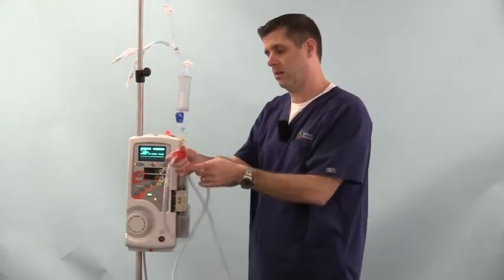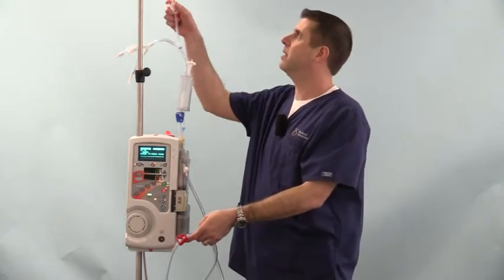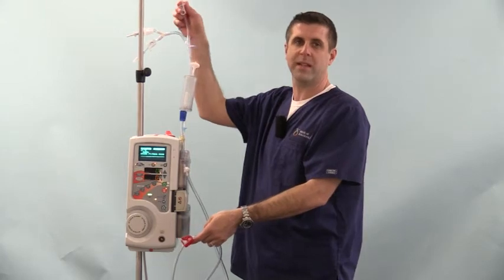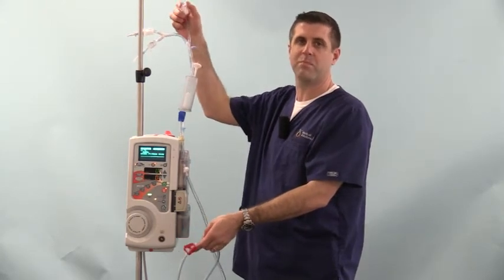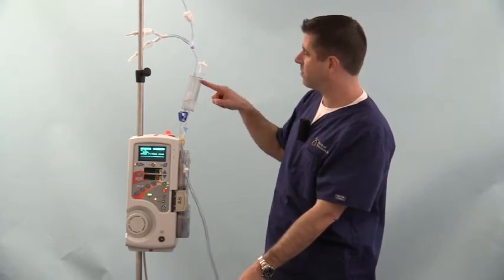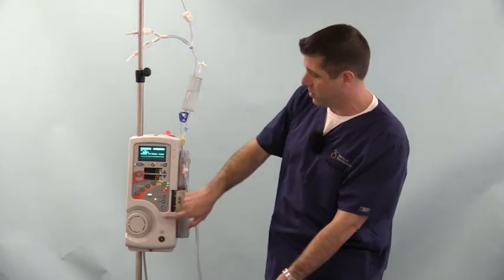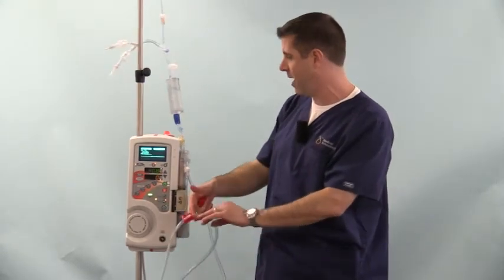Making sure that my patient line's not clamped, and I'm going to unclamp my fluid source from the triple spike where I've already spiked the bag. I'm priming with saline. I'm going to watch as the fluid flows into the triple spike. When I get between half and 2/3 full, I'm going to hit the auto prime, and it's going to fully prime the cassette automatically.